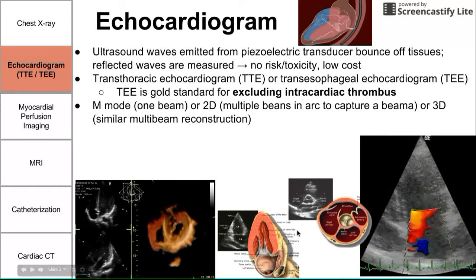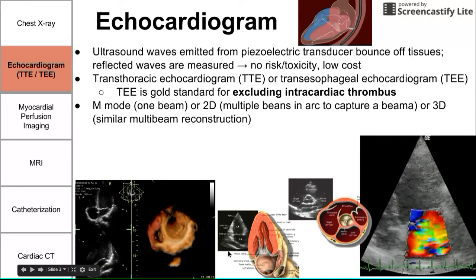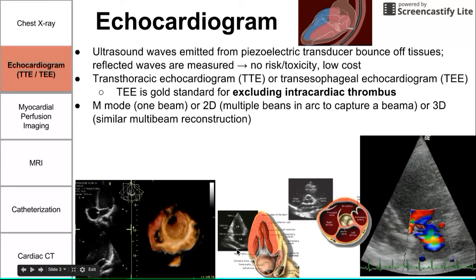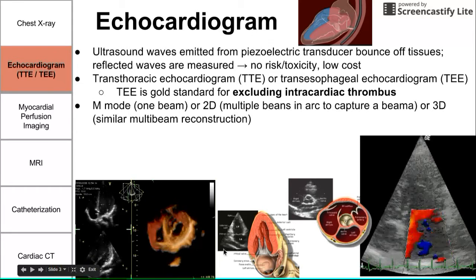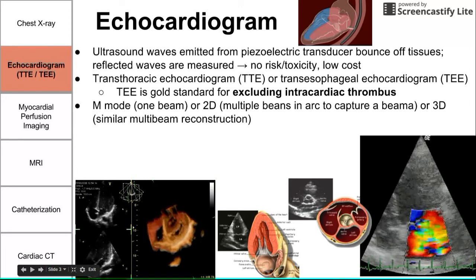And I believe that these were taken using a standard transthoracic echocardiogram, a TTE. They also have methods these days of making three-dimensional images, and that's all with the image processing on the computer.